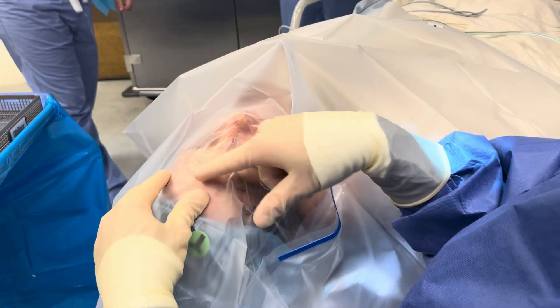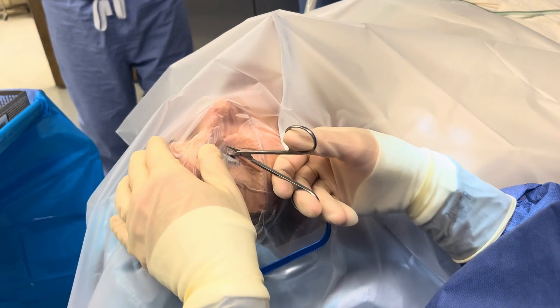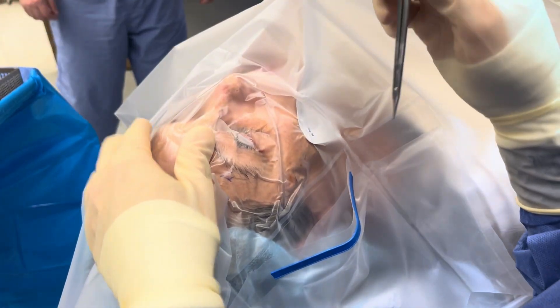Once the drape is in place, we want the sticky area covering an inch or two towards the ear. We want to use blunt tip scissors. I start in the middle, move nasal, and then come back the other half. Be careful at the lateral canthus not to cut the patient slightly.